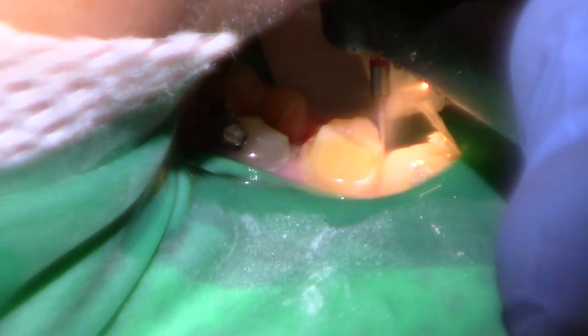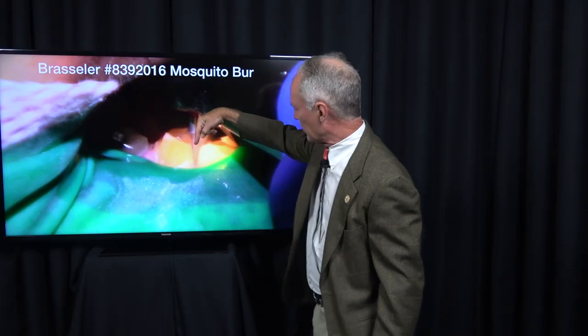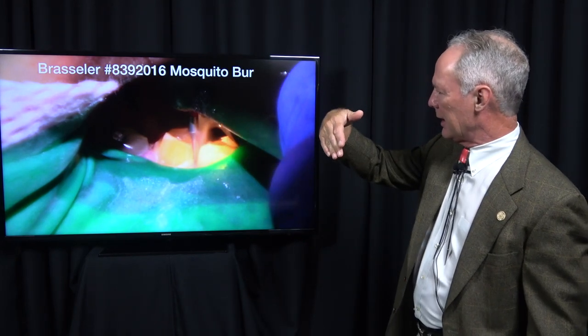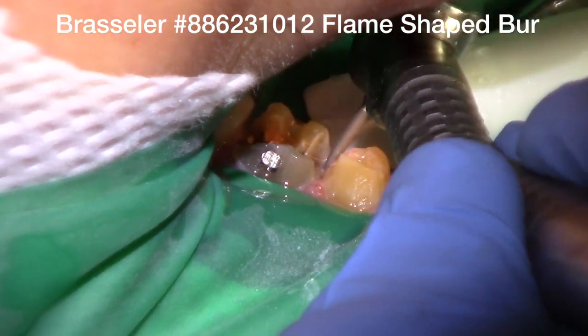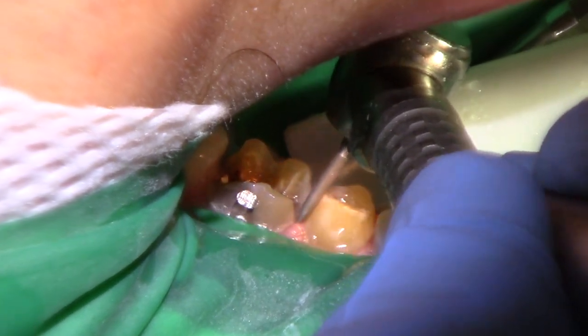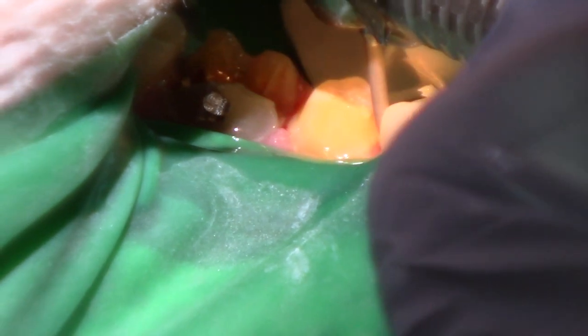This is a mosquito diamond, and it's very effective for interproximal breakage of the contacts. When you've got teeth that I call kissing teeth, and they're just right together, this is a very good burr to break that contact in the gingival aspect of the tooth. Then I'm going to come back with my flame-shaped diamond and polish those margins.